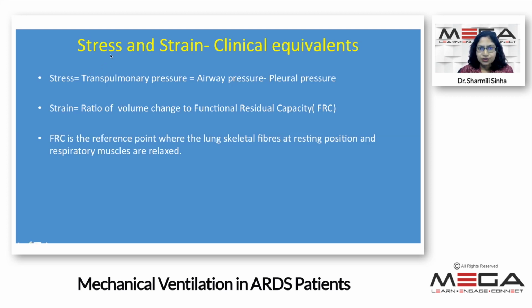These are called lung stress and strain. I'll not go into the details of this, because ARDS is a subject where you can spend an entire day discussing mechanical ventilation. So in the 25 or 30 minutes that we have, I'll just give a consolidated concept about the easy ways to initiate and continue ventilation support in these patients.